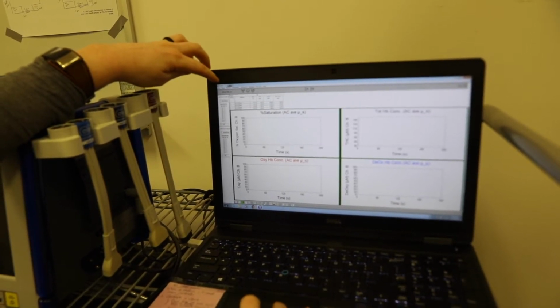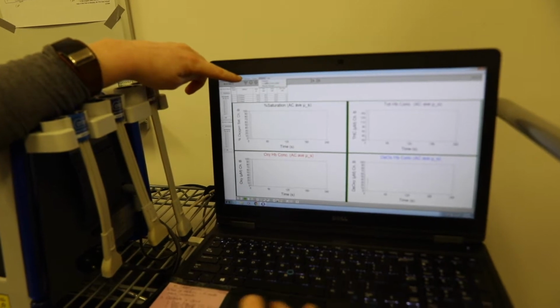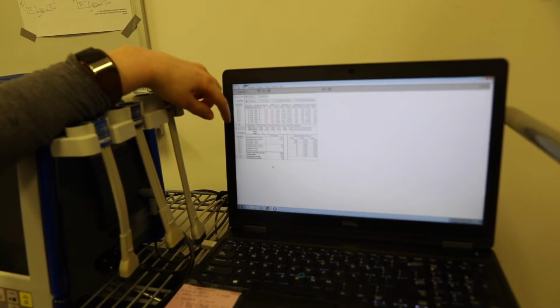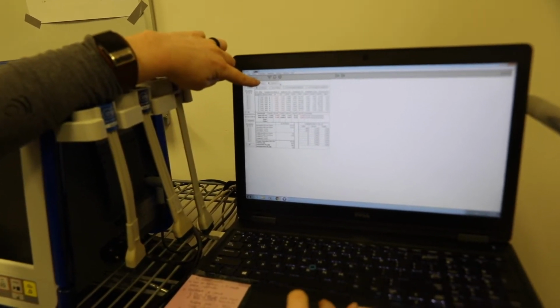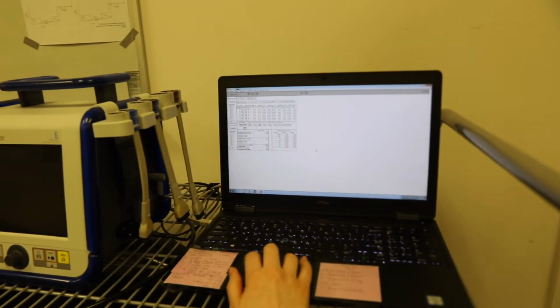Once you've done that, it's easiest to switch windows to the numeric window, so that it shows all of these numbers and these absorption and scattering numbers, which are the preset values on the calibration blocks for the NIRS probe, and that's what we want to calibrate to. Again, we also need to come up here and switch to detector B, or probe B, since that's the only probe that we have and that we're using.